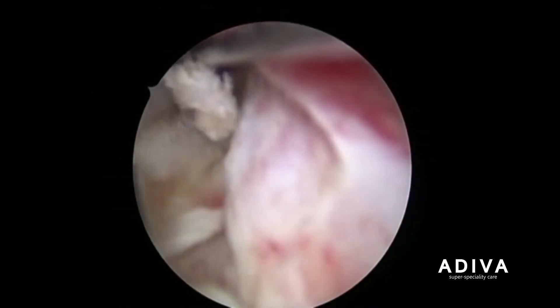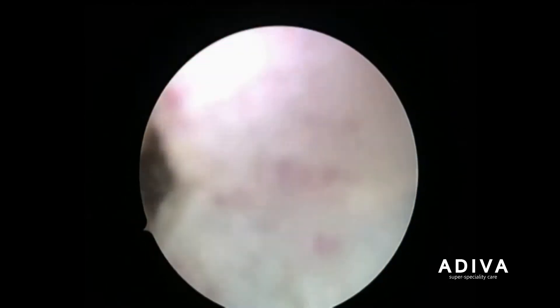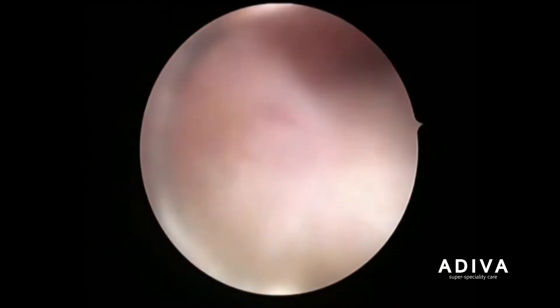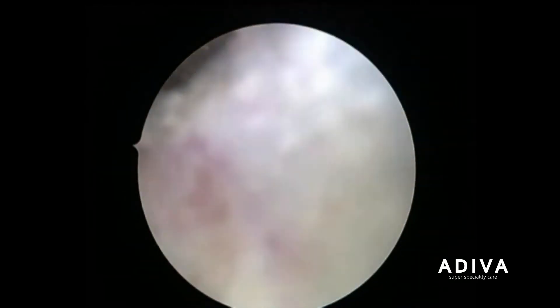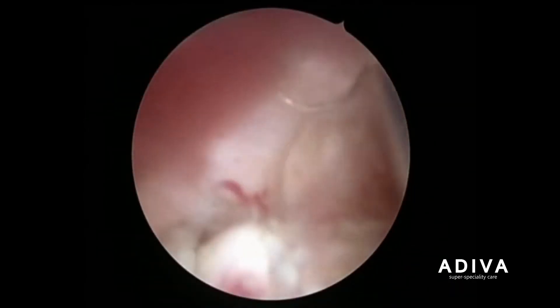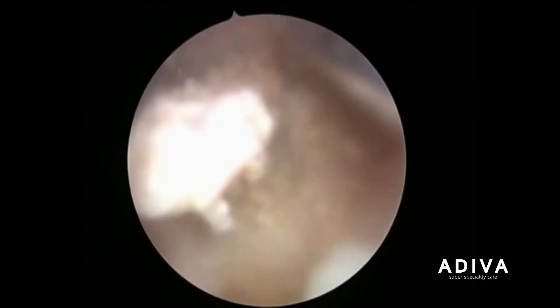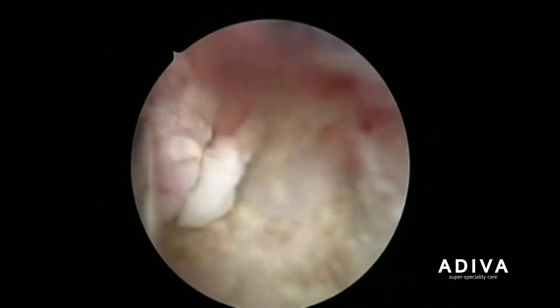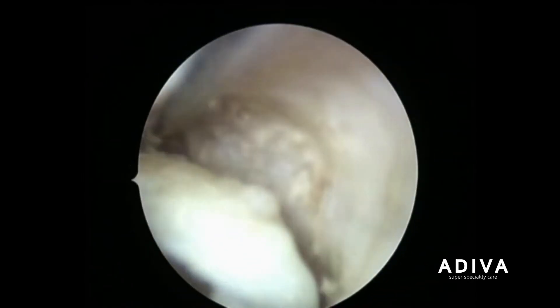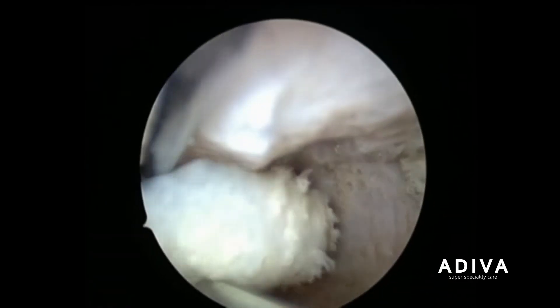I hope you are able to appreciate the cut pieces, how it goes all around removing the enlarged portion of the prostate. What remains behind is the capsule of the gland. The procedure takes about half an hour to one hour, and here we can see the adenoma cutting into pieces and getting removed.